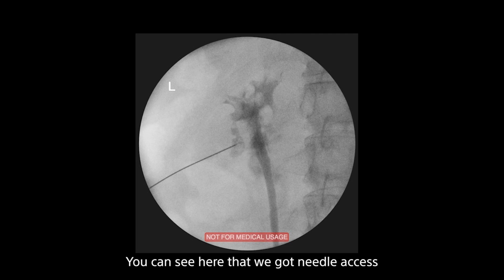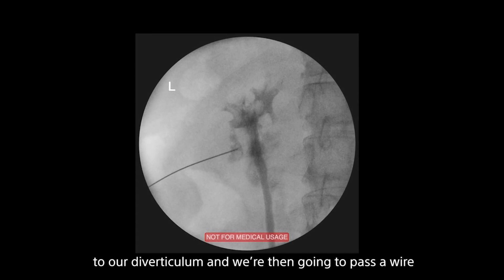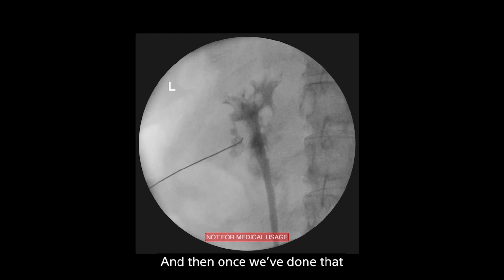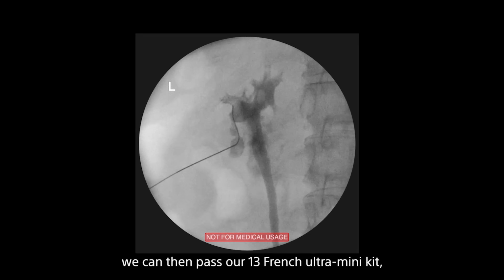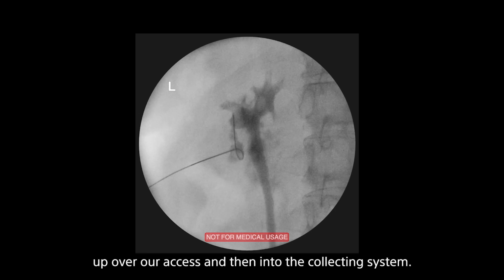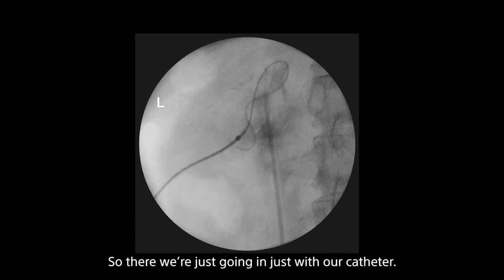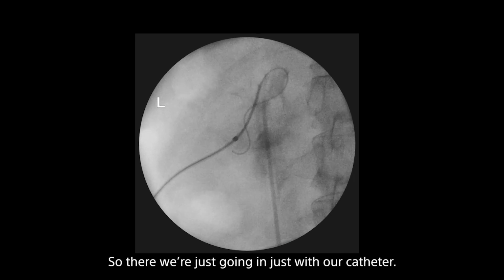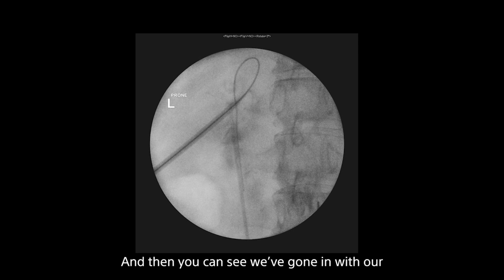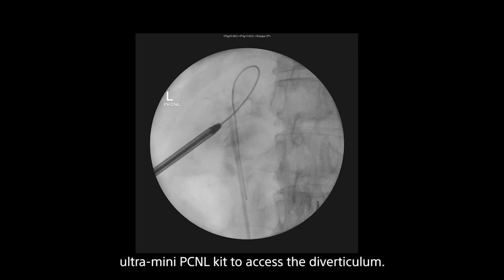You can see here that we've got needle access to our diverticulum, and we're then going to pass a wire, and we're going to dilate over into that. And then once we've done that, we can then pass our 13 French ultra mini kit over our access and then into the collecting system. So there we're just going in just with our catheter. We've got access then through the top of the diverticulum, so you can think we're widening the neck of the diverticulum a bit there. And then you can see we've gone in with our ultra mini PCNL kit to access the diverticulum.